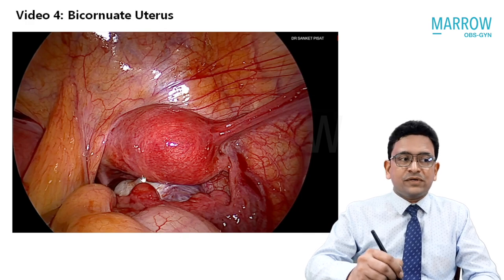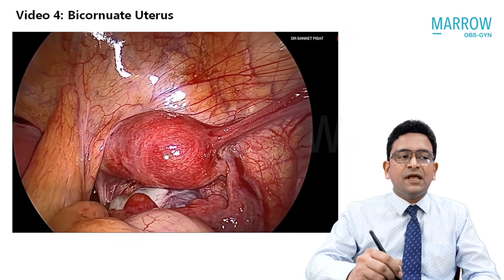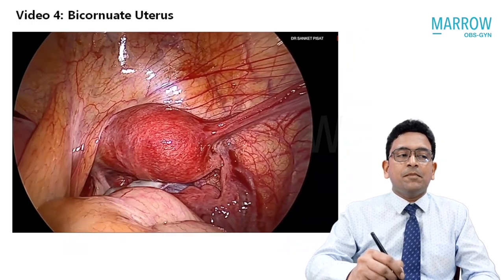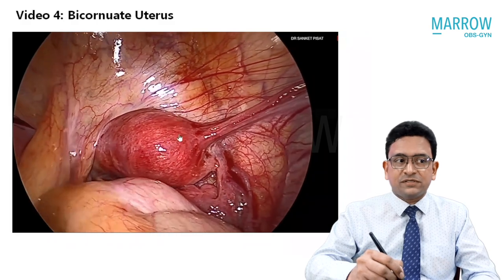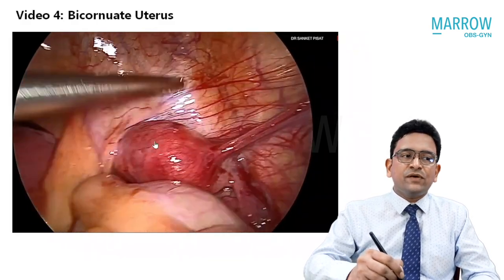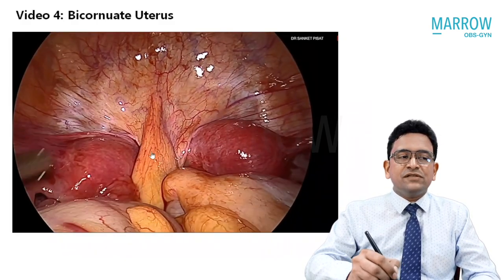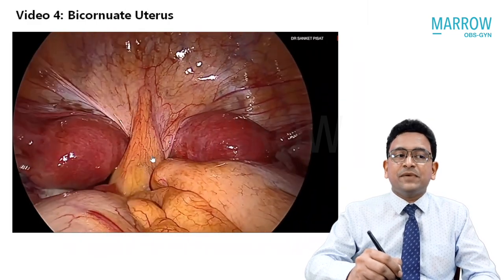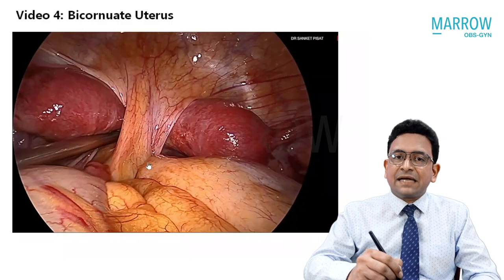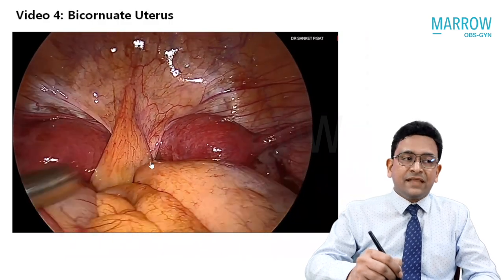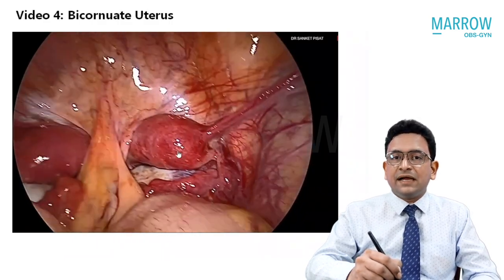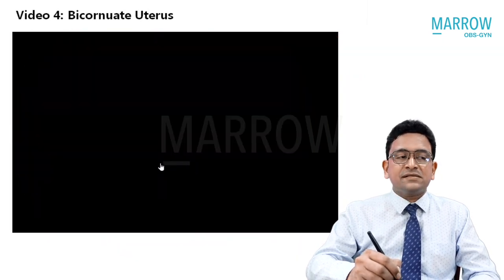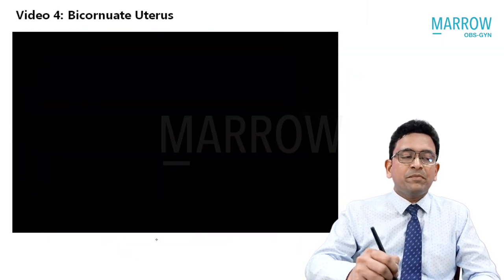Now let's take a look at a video of a bicornuate uterus. This is a laparoscopic picture, and you can see there is almost a near-complete duplication of the uterus. The reason for showing this video is that the cavity of these two separate uteri and the cavity of a completely septate uterus will look exactly similar on hysteroscopy. Therefore, we require a 3D ultrasound to differentiate between these two entities, or at least a laparoscopy to confirm before corrective surgery can be performed.